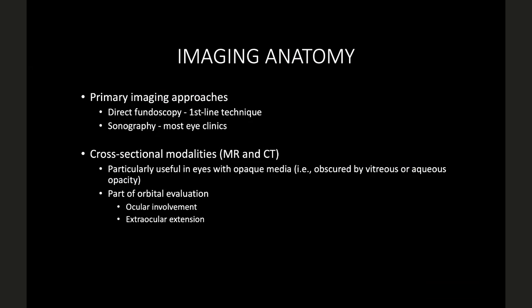Sorry, Dr. M, is this for the eyes or is this in general? In general, because I want to tie it down for you guys so you can have a really grounded opinion of these modalities. So in general, when is CT better? I'm a neuro intern, so I don't know if I'm right, but CT for bleed and then MR for other structures. Okay, so CT for bleed, yes, she's talking from a stroke standpoint, absolutely agree.